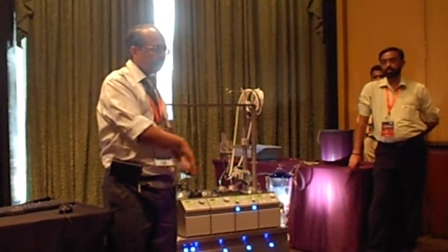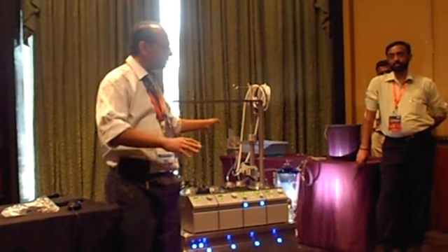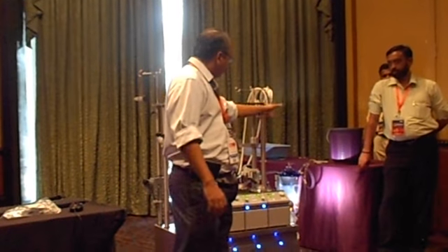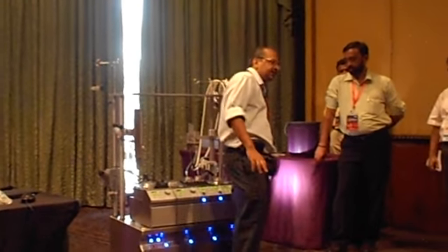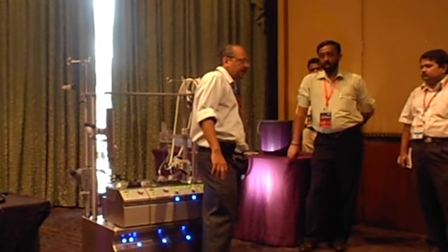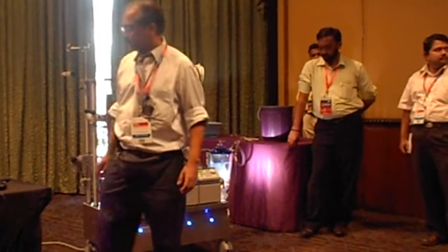This is a very dangerous situation you are in. Now you have rapidly cooled and you are changing the oxygenator, so you have to give him clamps. He will change, and you can change depending on the situation. If it is a clotted circuit, you would have to change everything. But if it is not a clotted circuit, you will only change the membrane.